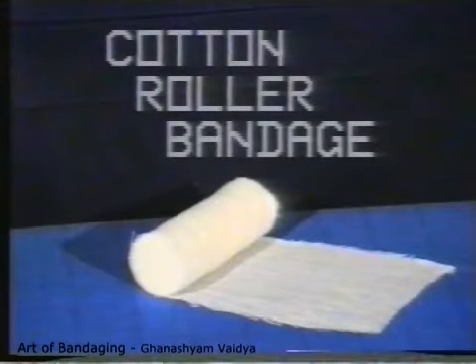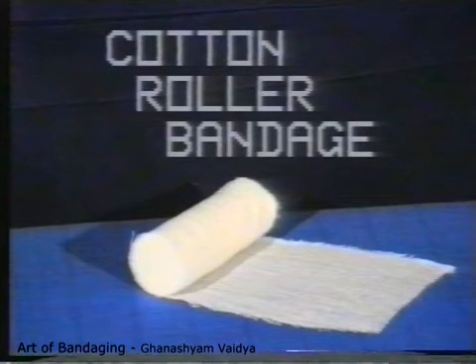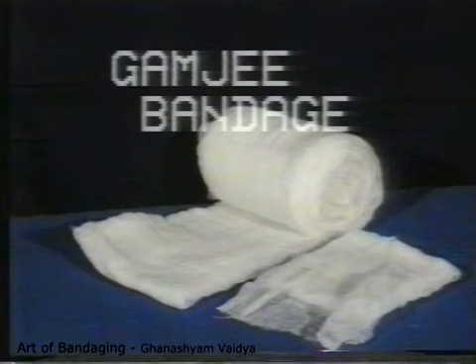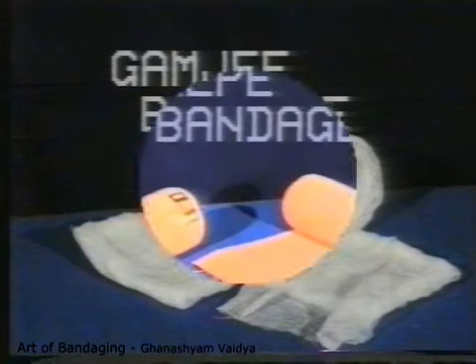Cotton roller bandages are the most commonly used bandages to hold dressings or splints in position. They are light and absorbent. They are also cheap and hence can be discarded after use. Gamgee bandage or cotton gauze bandage is a sandwich of cotton between two layers of gauze. They are used over large wounds with copious discharge because they can absorb large amount of discharge or pus. They are also used for pressure bandaging and under the plasters to protect the skin.